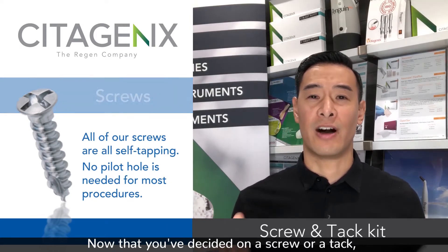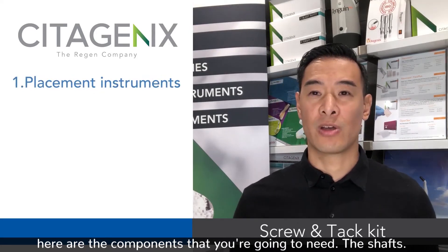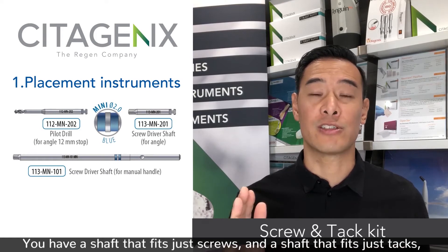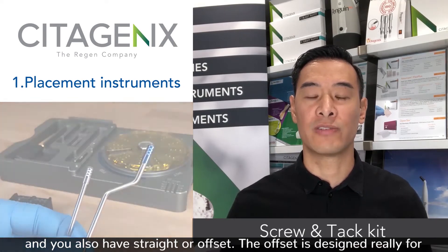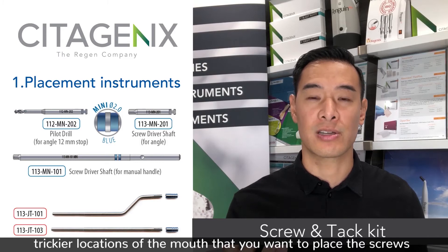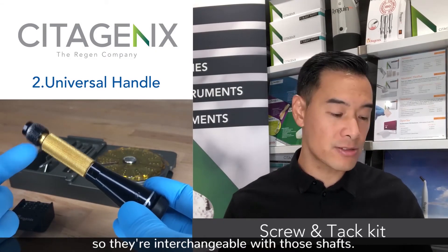Now that you've decided on a screw or a tack, here are the components you're going to need. The shafts: you have a shaft that fits just screws and a shaft that fits just tacks, and you also have straight or offset. The offset is designed for trickier locations in the mouth where you want to place the screws or tacks. The handles are universal, so they're interchangeable with those shafts.